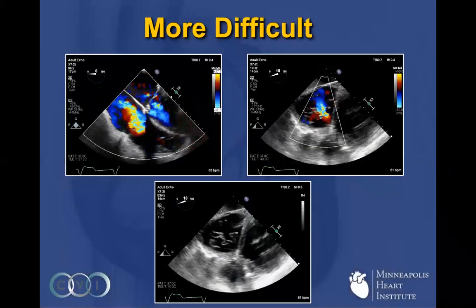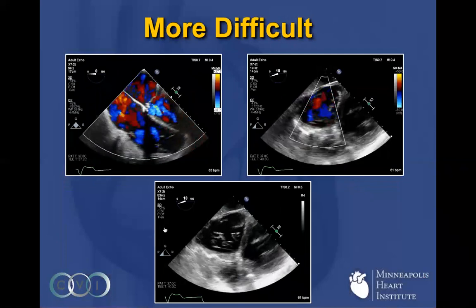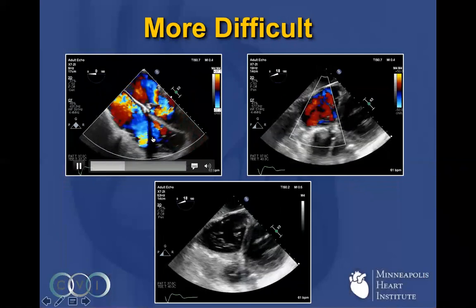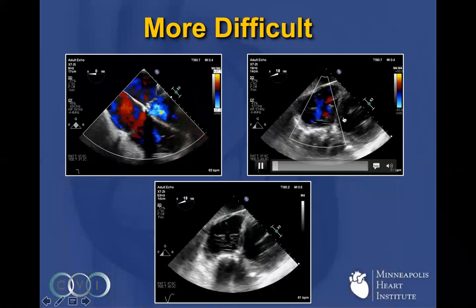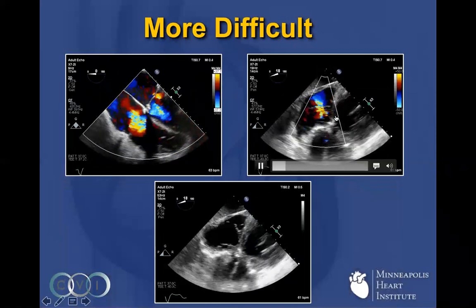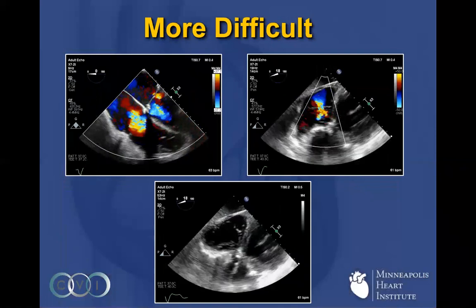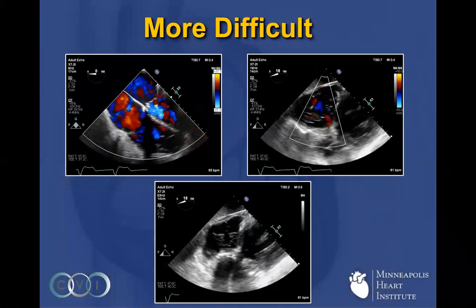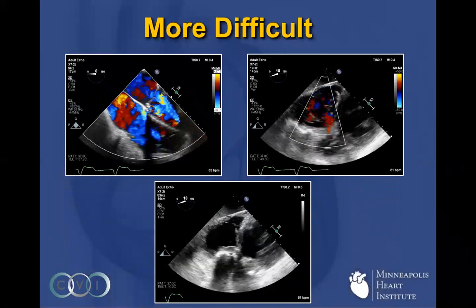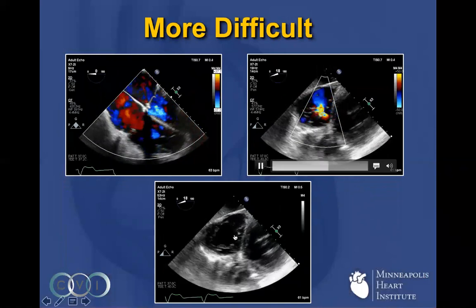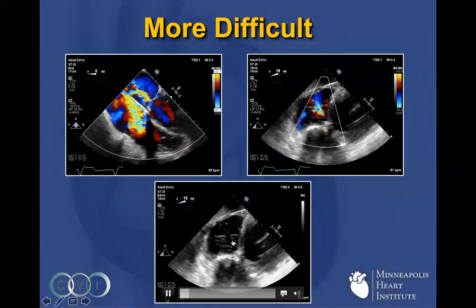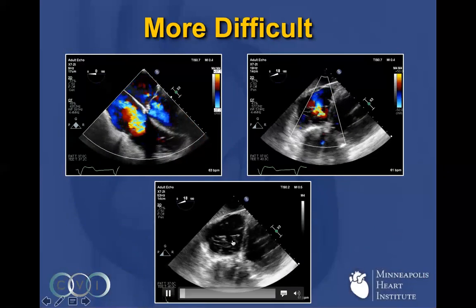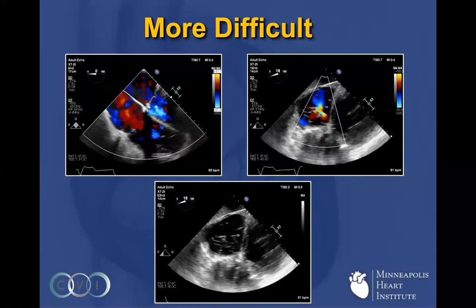Here's an example of a patient that's much more difficult. Here's a four-chamber view showing completely torrential tricuspid regurgitation. This transgastric short-axis view shows a very large amount of TR spanning both the anteroseptal and posterior septal commissure. Without color, you can see how wide these gaps are — this gap was well over a centimeter. It would not be easily treatable with the MitraClip device.